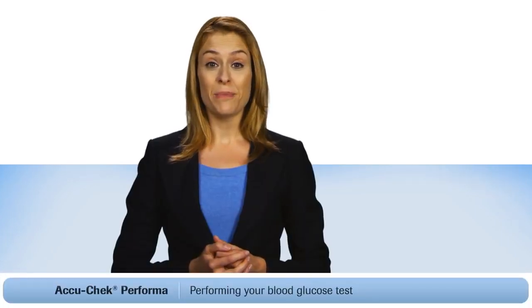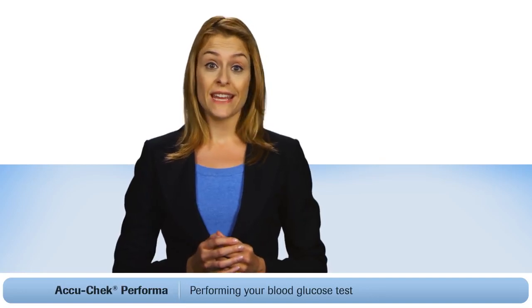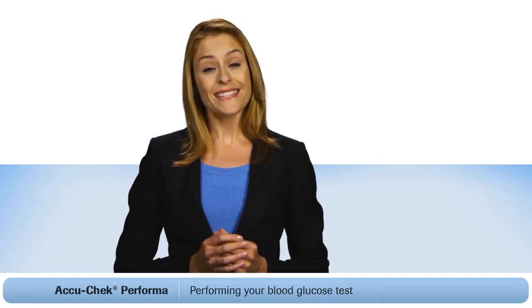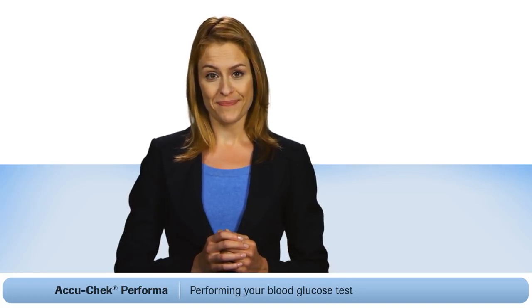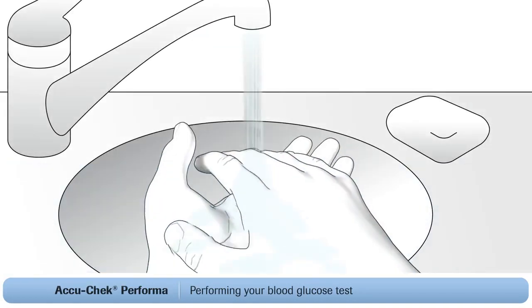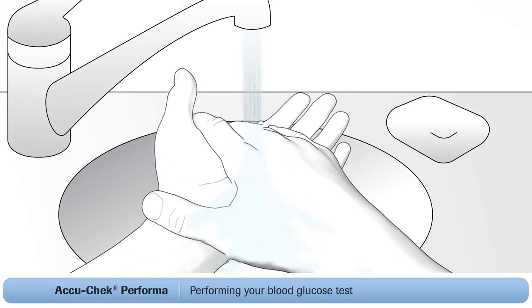Now you're ready to do a blood glucose test. First, you'll need to choose a finger to take a blood sample from. It's best to alternate between fingers, as they can become sensitive over time. Remember to always wash your hands with warm soapy water and dry them well before obtaining blood.